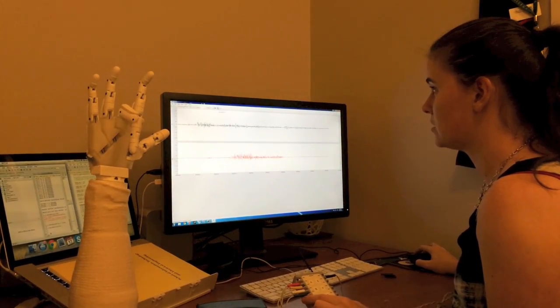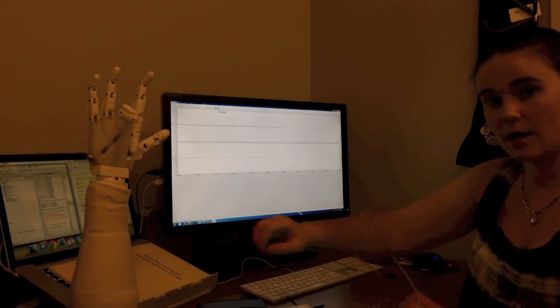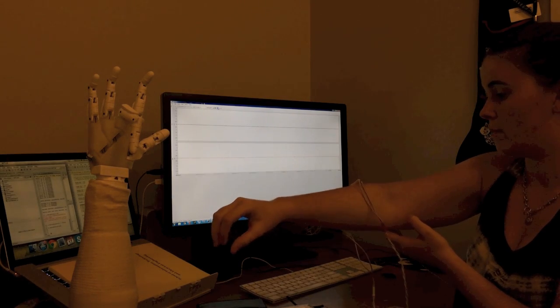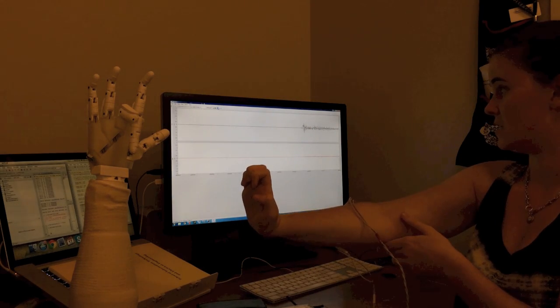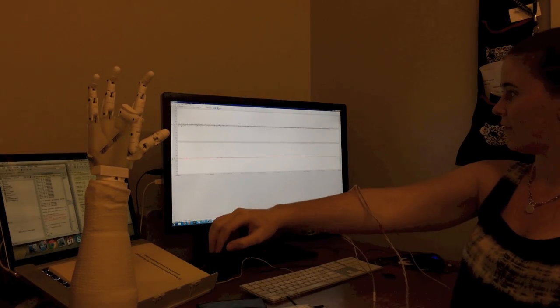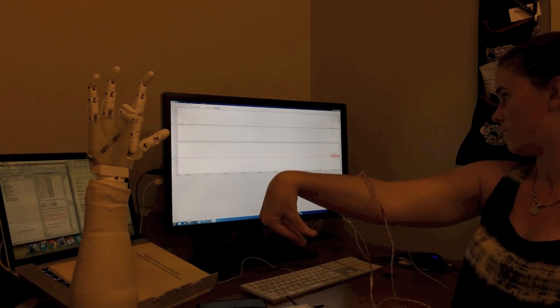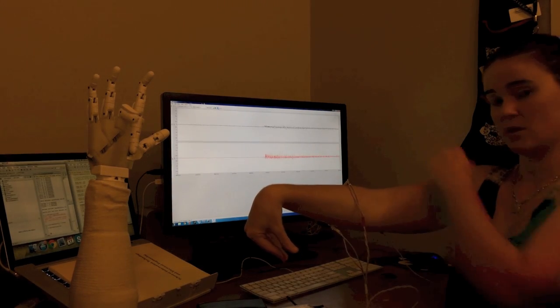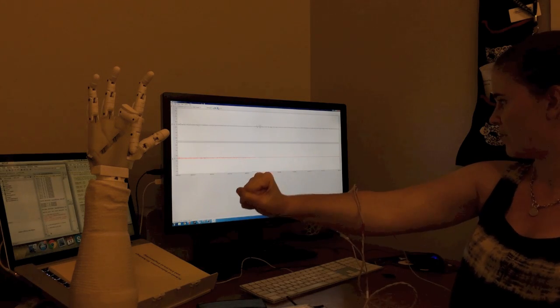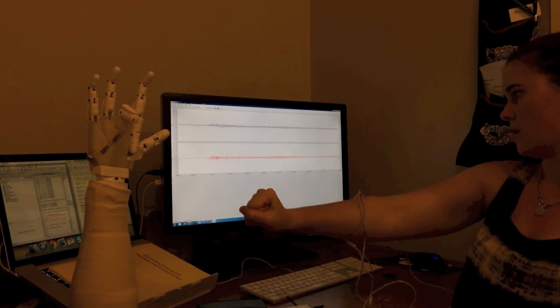So if we run this, you can see there's a signal going through. Now, if I move my arm in this direction, you can see that top channel there, we can now see a signal. And if I relax, it goes back down again. And now if I do this motion, you can see that bottom channel is nice and active. And again, relaxing. And if I clench my fist, you can see both channels are quite active.